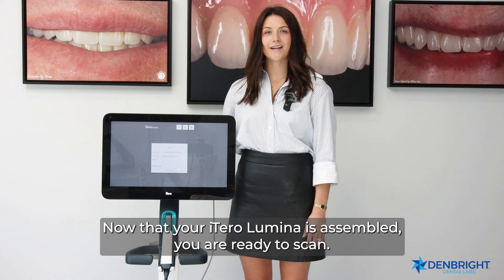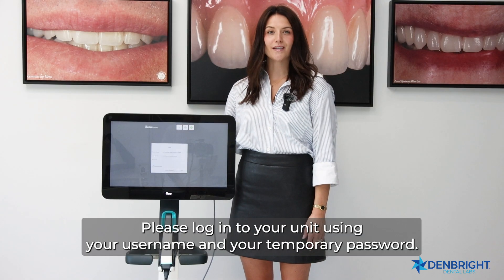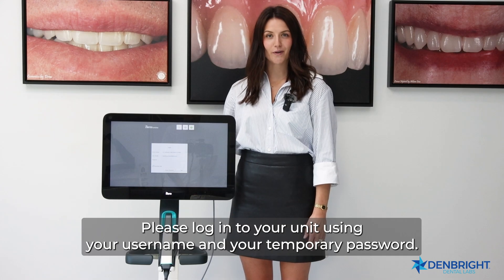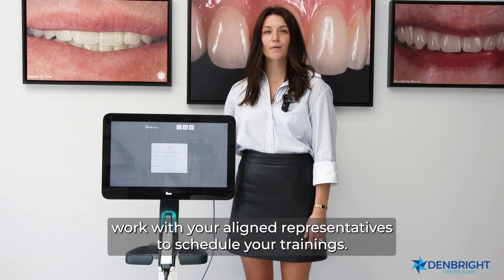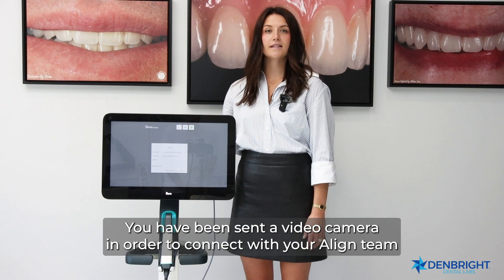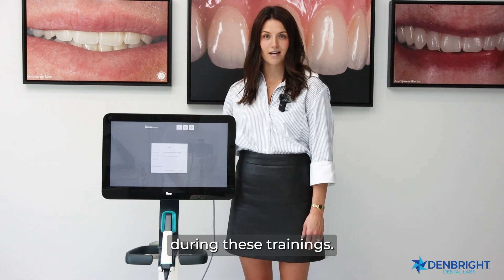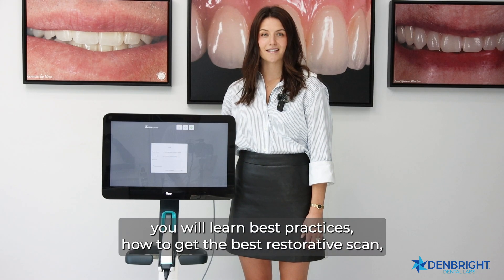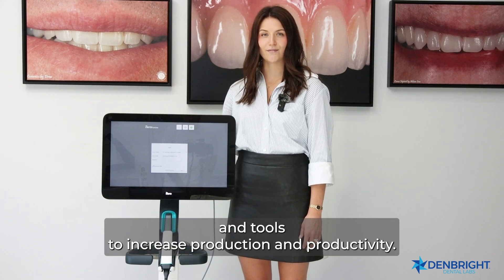Now that your iTero Lumina is assembled, you are ready to scan. Please log into your unit using your username and your temporary password — you have been sent a link to update your password. For next steps, work with your Align representatives to schedule your trainings. A video camera has been sent for connecting with your Align team. During these trainings, you will learn best practices, how to get the best restorative scan, and tools to increase production and productivity.